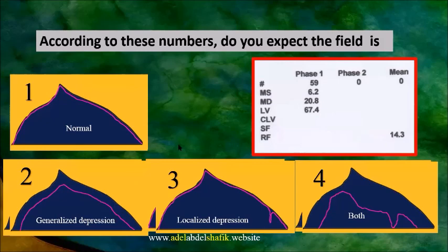Okay, I can read the question of Dr. Wissal. The question is, can you tell me the normal values of the mean deviation, pattern standard deviation, and the limits for interpretation of each?